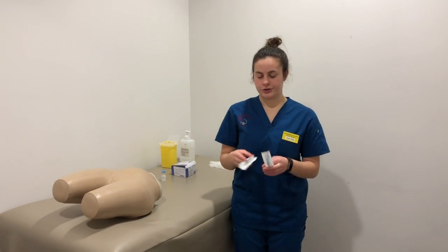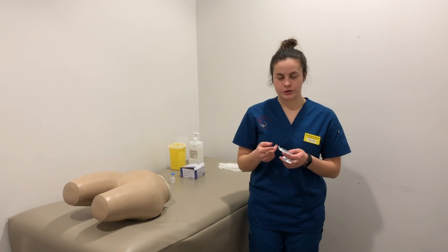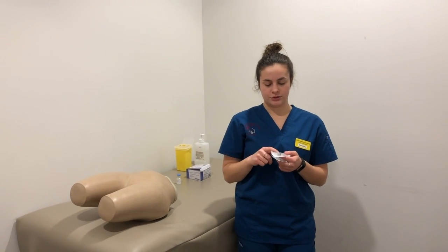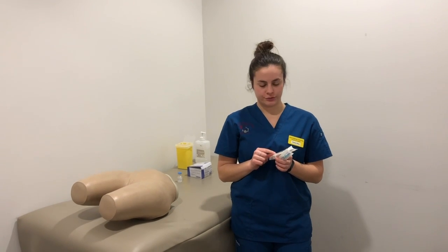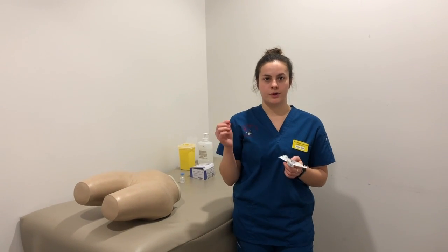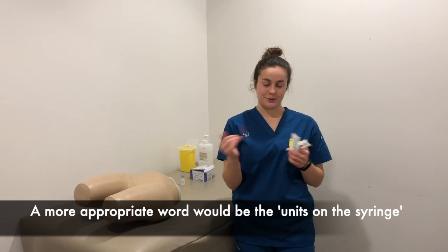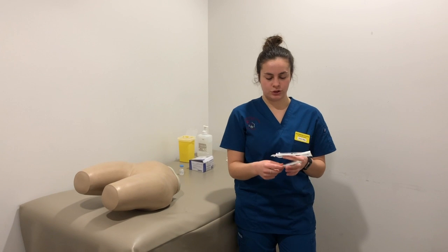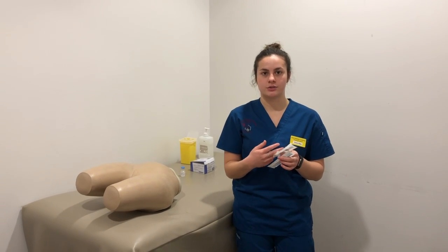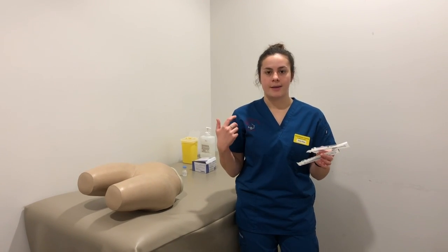Another thing that can differ on your needle is the size of the syringe. So there's 2 things that you mainly look for when choosing your syringe size. First of all, you want the scale to be accurate to your dosage. So you want the decimals to show up to what number that you need to inject, so it can be accurate. As well as you want to choose a syringe with a shorter pullback, so that it's more comfortable when injecting the medication.